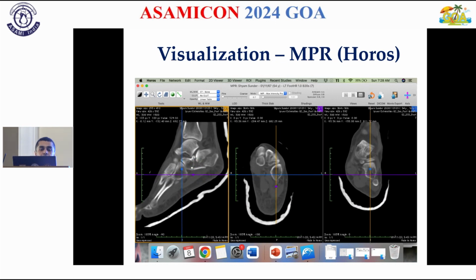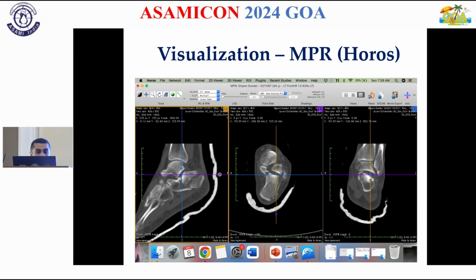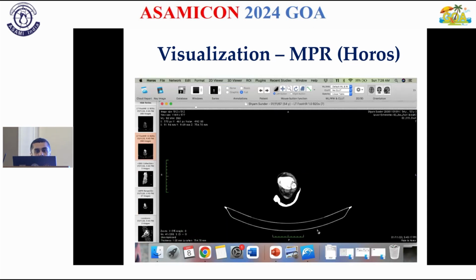So, for example, if you wanted to classify this intra-articular calcaneus fracture, the book says the foot has to be positioned in a certain way. But you can always rotate the axis, make it parallel to the subtalar joint, and do the same thing, right? So the same principle of having the X-ray beam or the line parallel to a joint can be easily employed. Very, very simple thing, very easy to do.